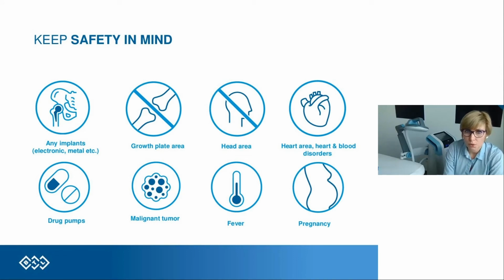So this is like tumors, fever, pregnancy, and so on. In these cases, we have to be sure that we cannot apply this modality.